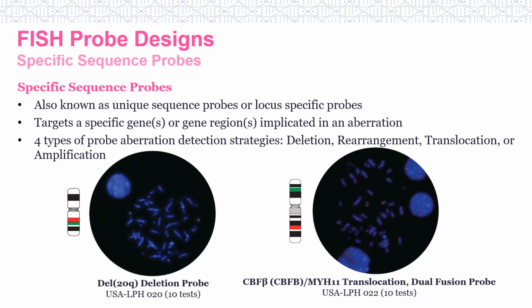Another type of FISH probe design to be aware of is that of an amplification probe, which will not be covered in today's presentation.